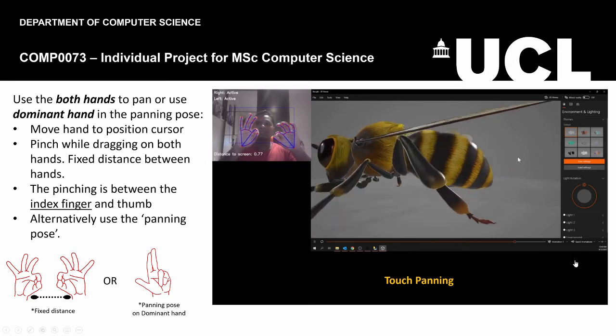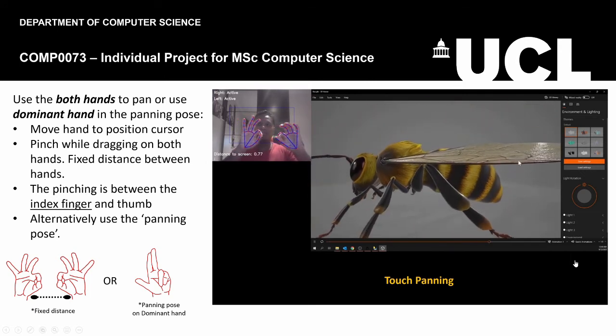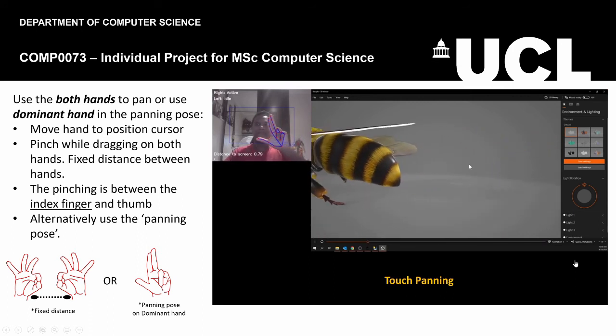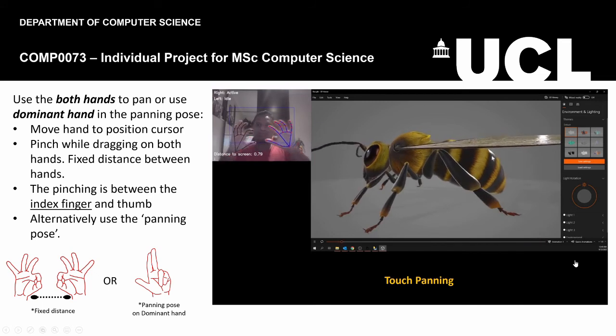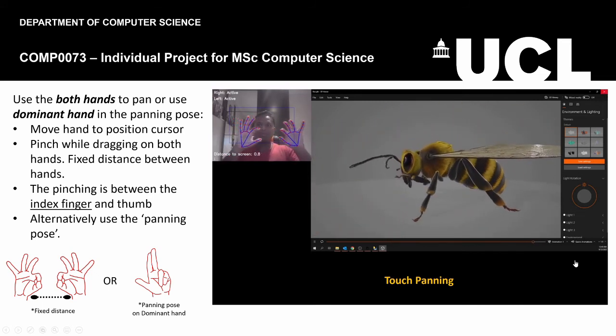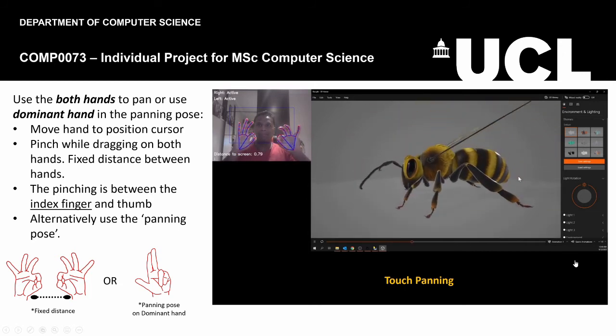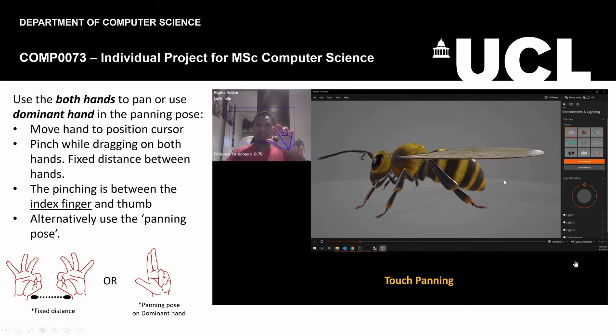There are two options for touch panning. The first one is to index pinch on both hands and move both around while keeping your hands equidistant from each other. This is the better option if you want to pan and zoom at the same time. The second option is a dedicated panning pose, which is the double barrel gun pose that you can see. And you'll see me use that in a bit. And yeah, this option is just better for pure panning.